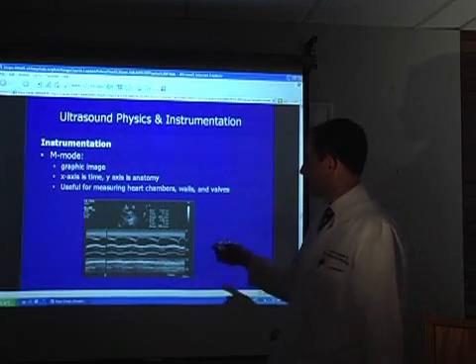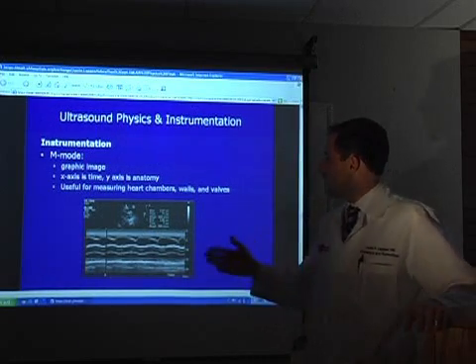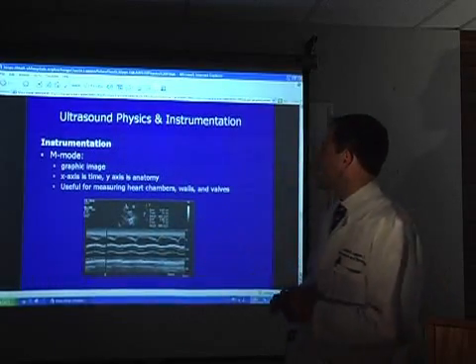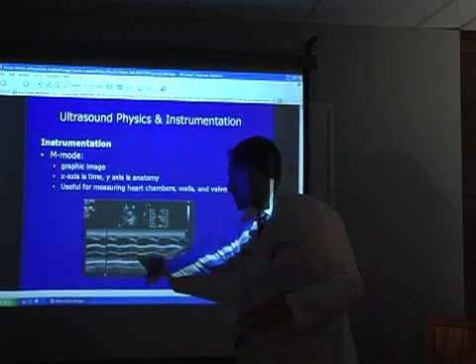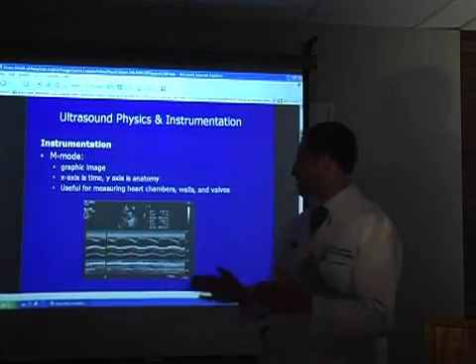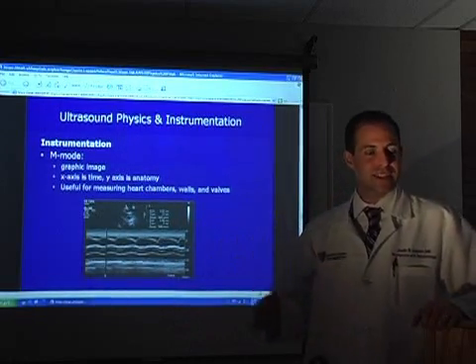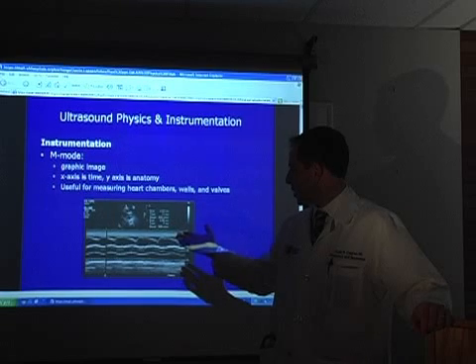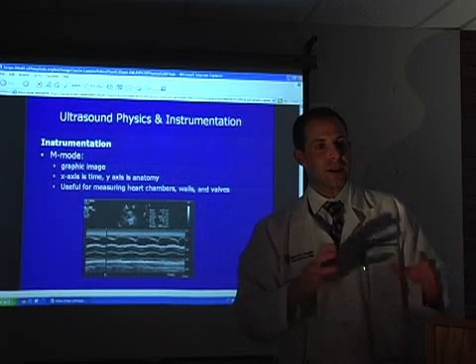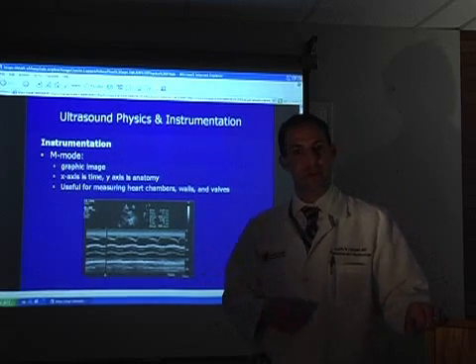Here's an example of M-mode. In cardiac applications you may see this, and on labor and delivery you can get a fetal heartbeat this way too. It's a graphic image — your standard 2D B-mode image is shown up top, and the application below shows time on the x-axis with anatomy on the y-axis. You can look at changes over time, measure intervals of heartbeats, and examine cardiac parameters like heart chambers, walls, and valves. It gives you a way to measure the change in that B-mode image over time.